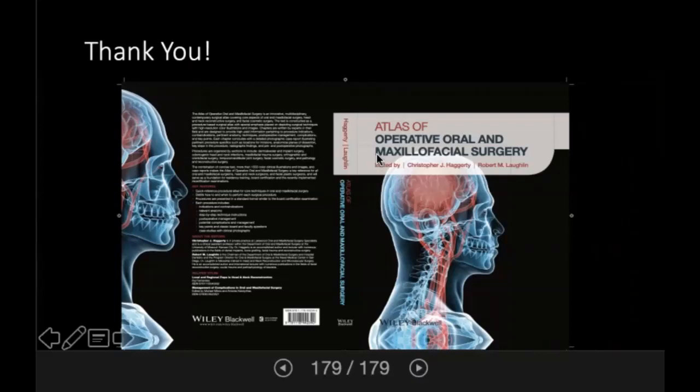I do sometimes place immediate implants. Sometimes I can get lucky and have a patient like we showed, like Paul, where he does have 5 or 6 remaining teeth and we can place the dental implants around the pre-existing teeth. Now, there's absolutely nothing wrong with placing implants into extraction sites. You do, of course, have a higher complication rate when you do that. Sometimes you may not get a very high insertional torque value, as we discussed, which does correlate with implant stability. Sometimes when you place an immediate implant and you don't get the appropriate torque value, placing the immediate denture on the patient can put a lot of pressure on the implant and cause it to fail.